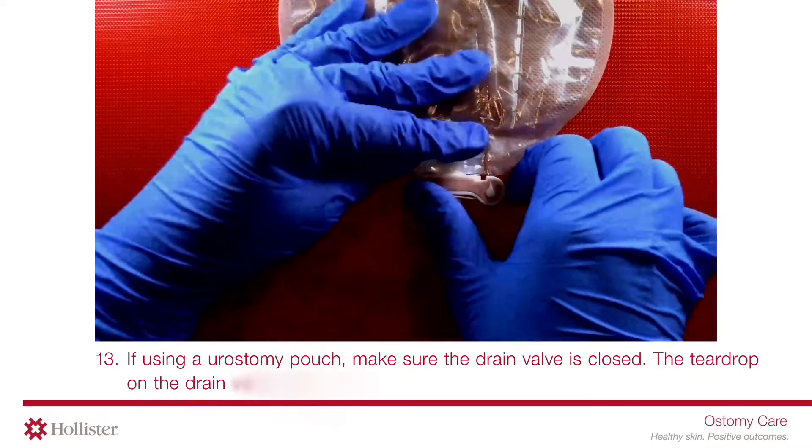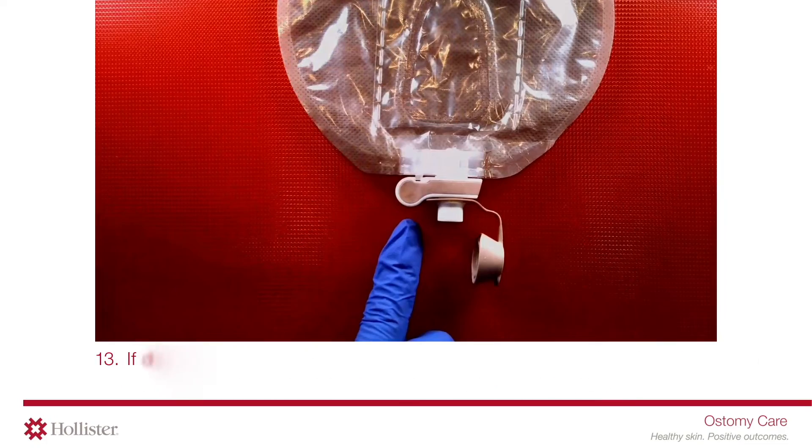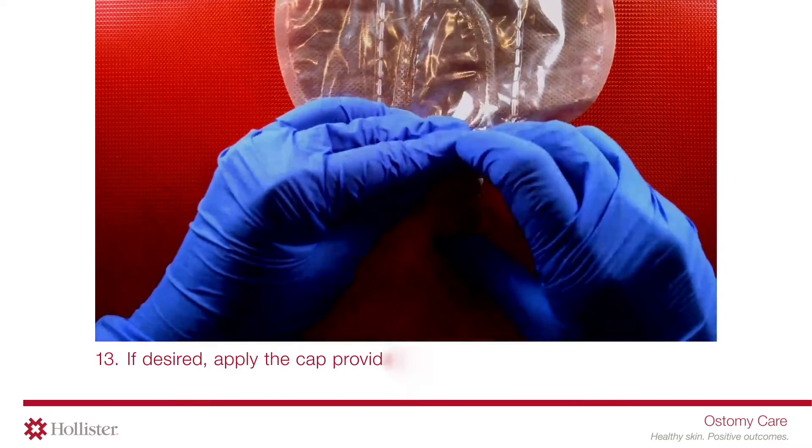The teardrop on the drain valve should face the body side of the pouch. If desired, apply the cap provided in the box.